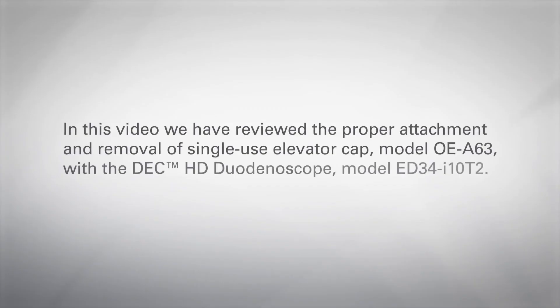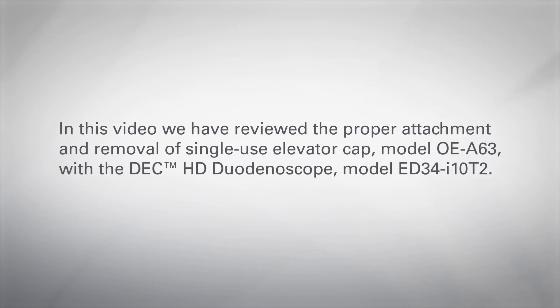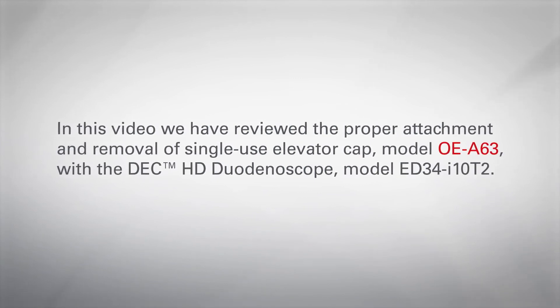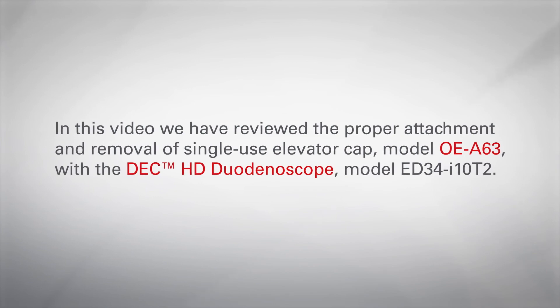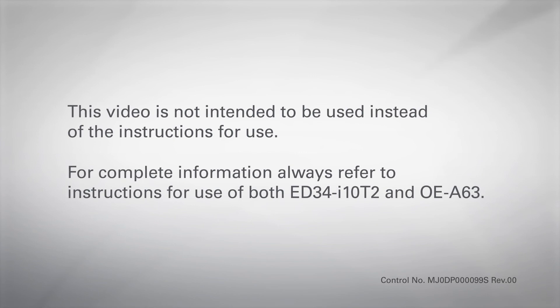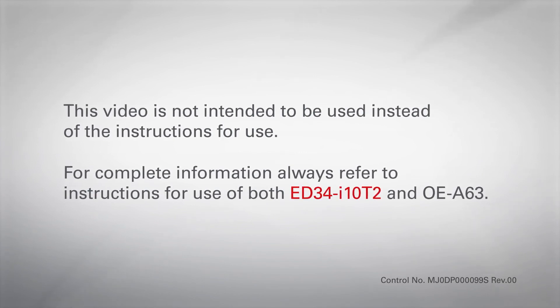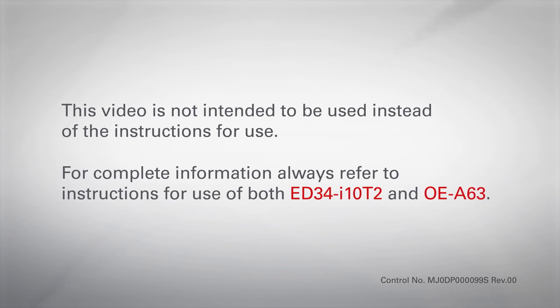In this video, we have reviewed the proper attachment and removal of single-use elevator cap model OE-A63 with the DEC-HD duodenoscope model ED34-I10-T2. This video is not intended to be used instead of the instructions for use. For complete information, always refer to instructions for use of both the ED34-I10-T2 and OE-A63.